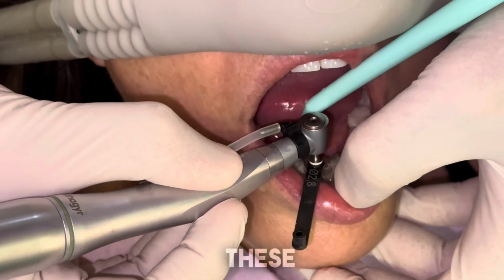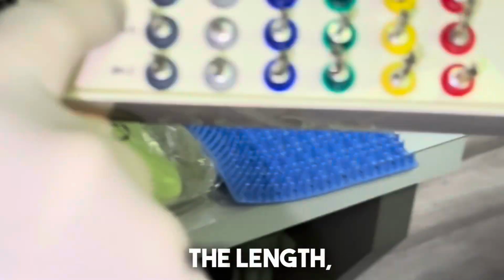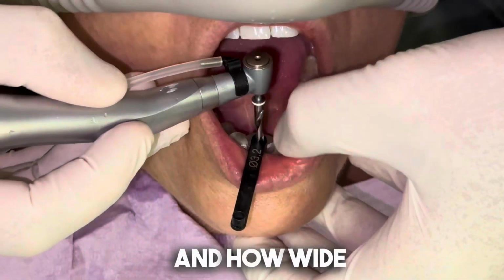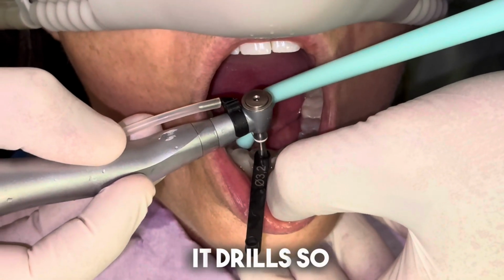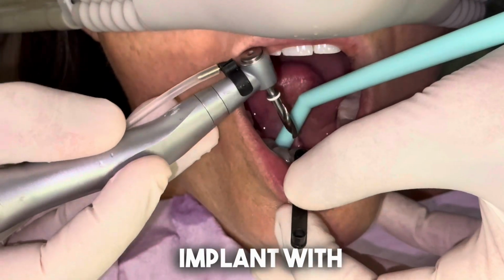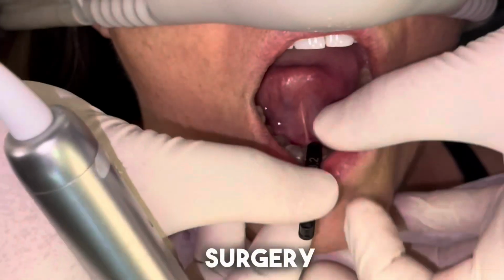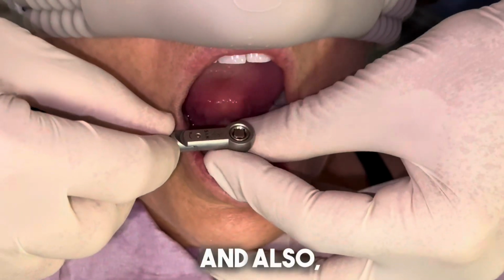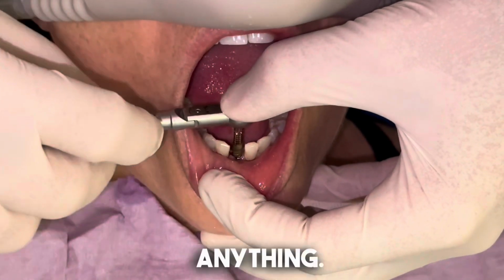And remember, these drills control the length, how far deep it goes down, and how wide it drills. So we can safely place the implant with the guided surgery because we have virtually planned the case. And also, as you can see, we did not flap anything.